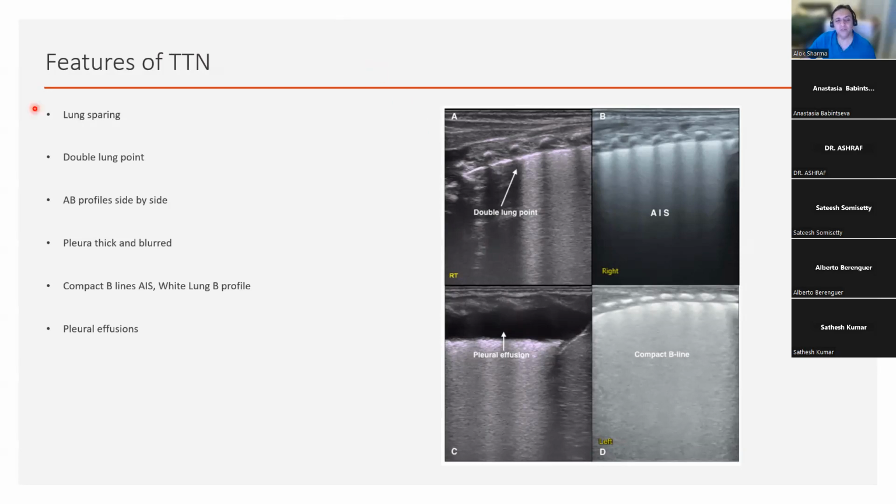Any other questions before we finish? Yes, Dr. Alok, about the hydrothorax and the pleural effusion. If this is a diaphragmatic hernia repaired, the lung is still hypoplastic. Very good. It will be a secretion from the intestine. It's not between the pleura. Yeah, so you're right. Again, that's why I would say that I tend not to use the word hydrothorax. So if you've got a congenital diaphragmatic hernia that's been repaired, often the bowel's been pushed down, the lung is collapsed and is gradually getting recruited. So the fluid that then accumulates in that particular area would be very different, but may actually present very similar to the way an effusion presents.